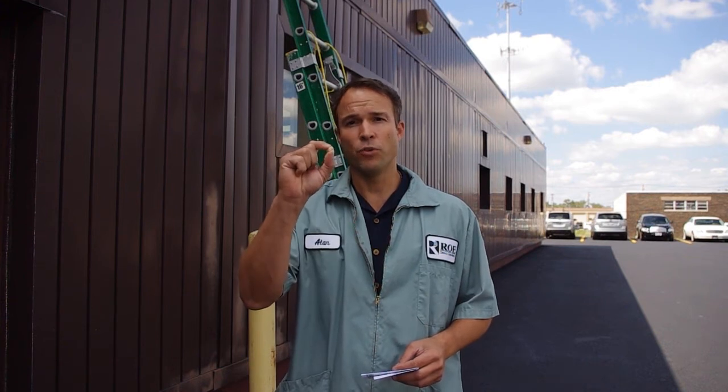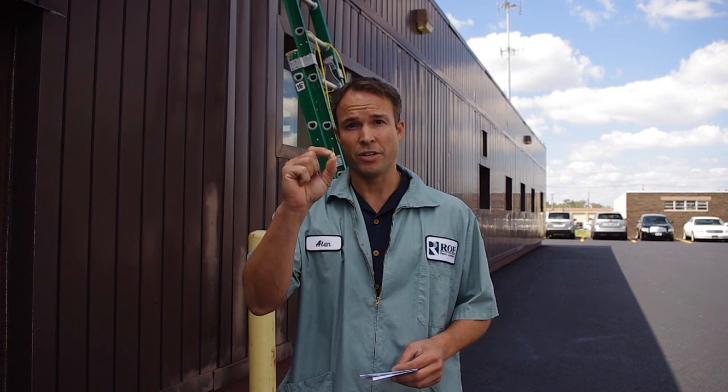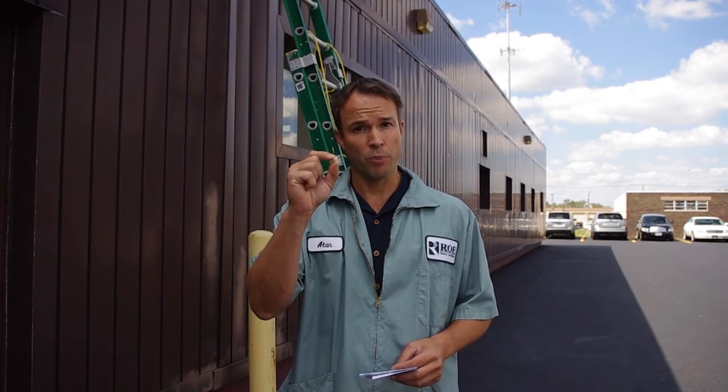Today we're going to test the strength of all zirconia restorations. This is a fully milled, full contour restoration, monolithic in nature. In other words, it's not a coping with porcelain, it's a full contour zirconia restoration. We call it TLZ.